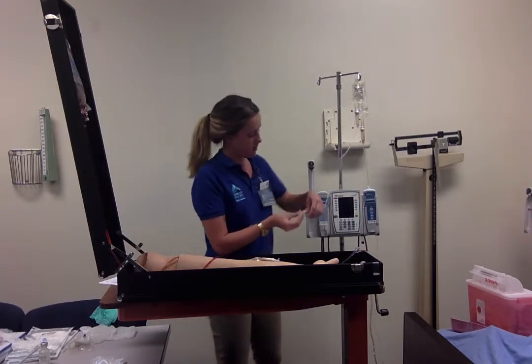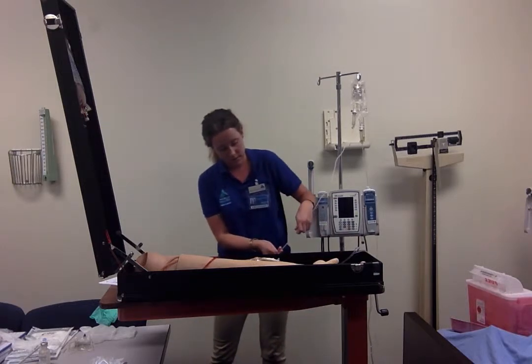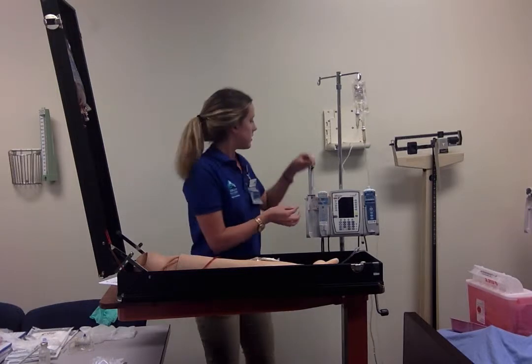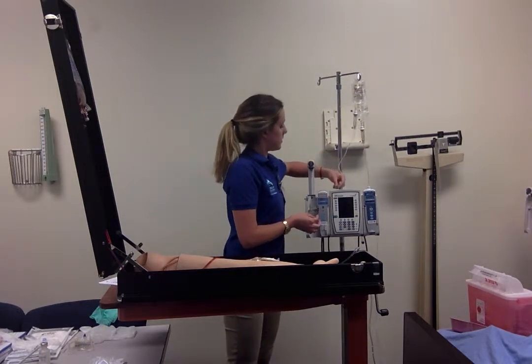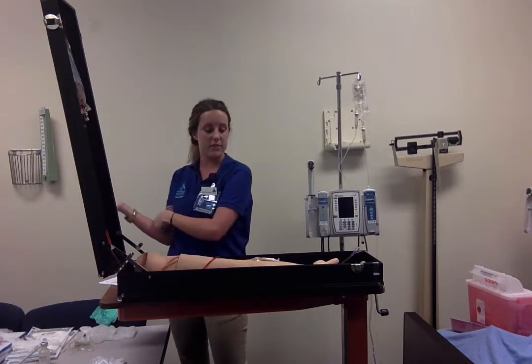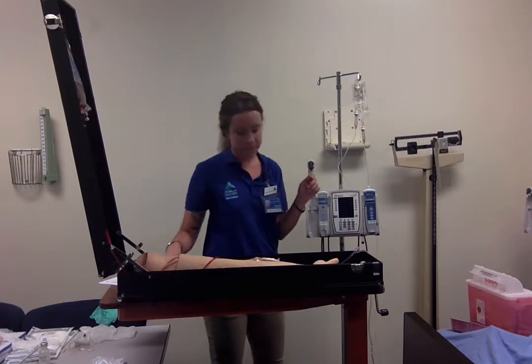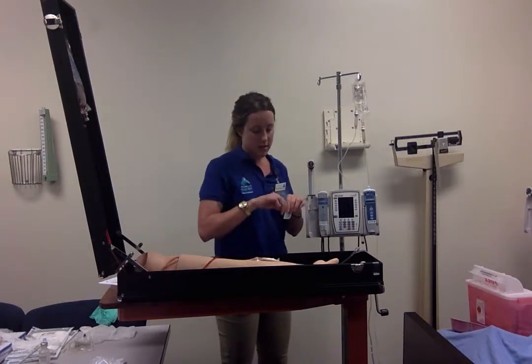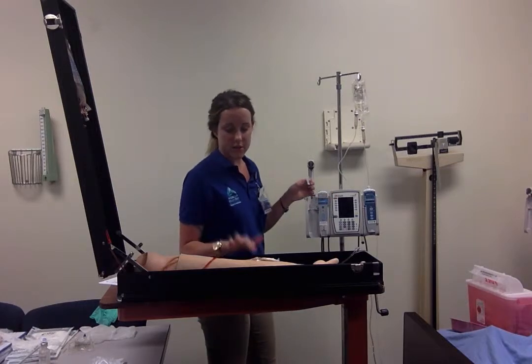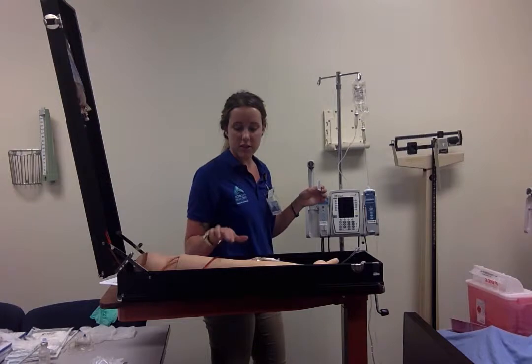Put a trash can underneath me. Okay, we're good, we're primed. I'm going to just set that right there. I'm going to clean my hands, put on the clean gloves, and now I'm going to grab an alcohol wipe and make sure there is no inflammation or phlebitis. The site looks good. There's no pain, right?